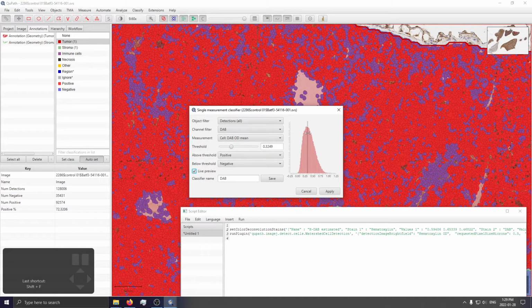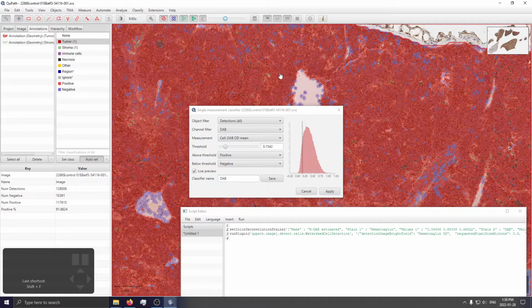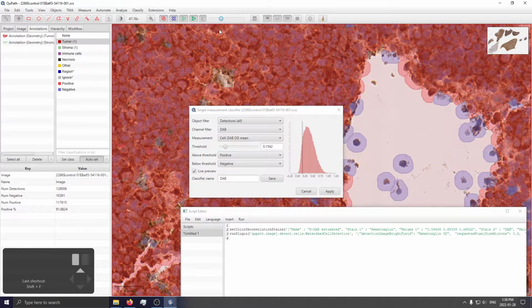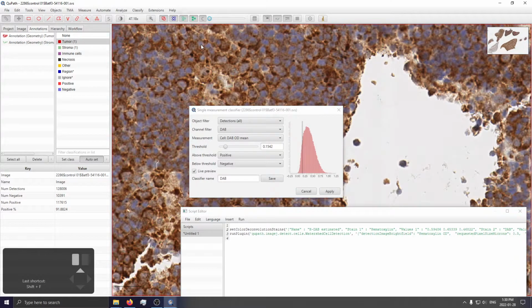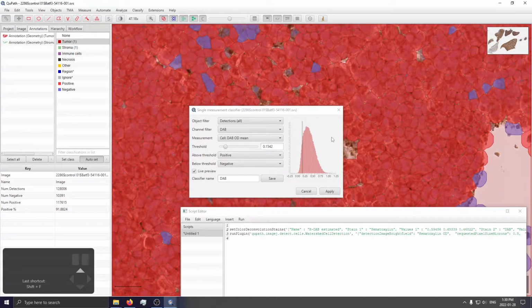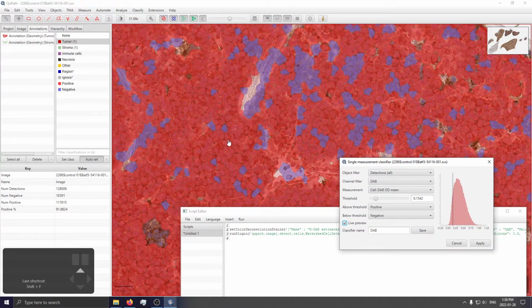You can tune what the exact threshold is, and again, this depends on whatever it is you consider to be positive for true positive staining. There isn't any right answer, and it might even differ drastically depending on the pathologist setting this threshold. But for any clinical related work, it's always good to get a pathologist's feedback on it, as they're generally considered the gold standard. And again, all the more reason to solicit HistoWiz's services, because they have a dedicated team of pathologists working 24/7, specializing in a variety of cell subtypes, or a variety of tissue types.